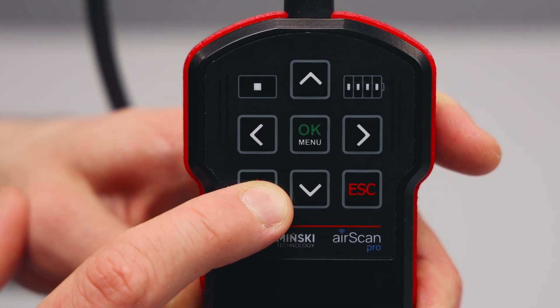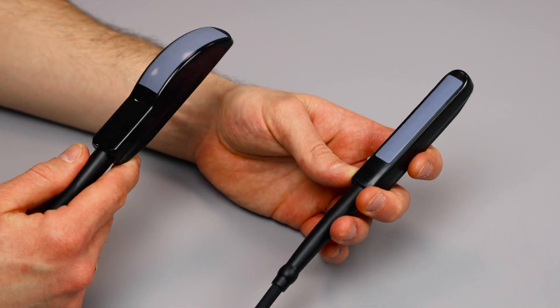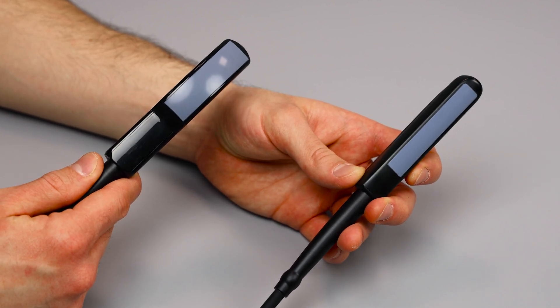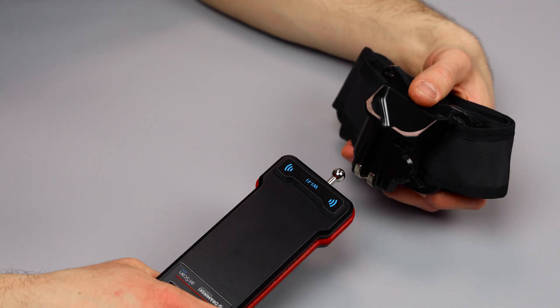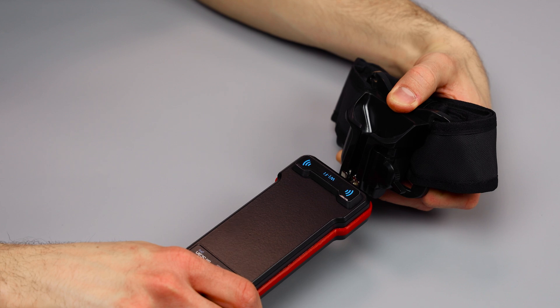An ergonomic membrane keyboard with a battery level indicator improves workflow. AirScan Pro is available in two versions with a rectal linear and a rectal convex probe. The set also includes a waist belt with a quick mount system to prevent the ultrasound scanner from spontaneous unfastening.